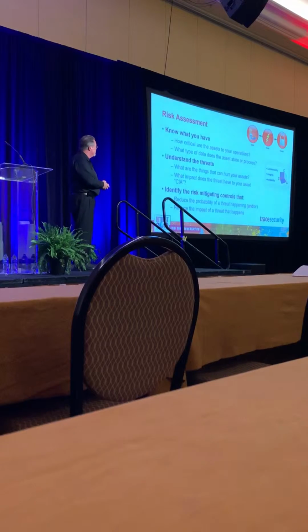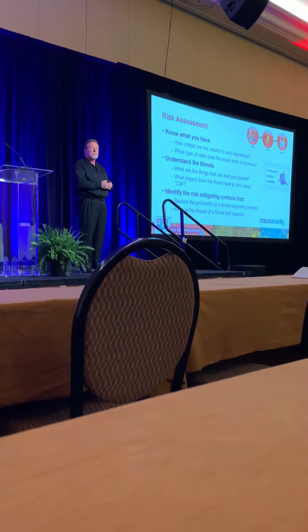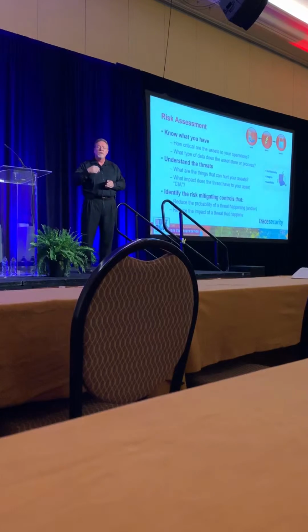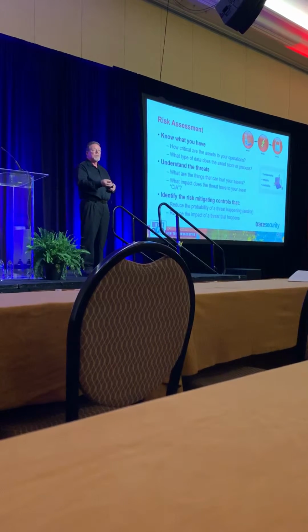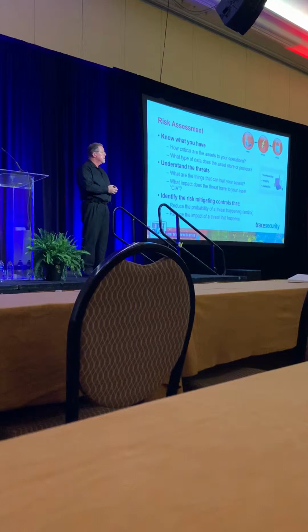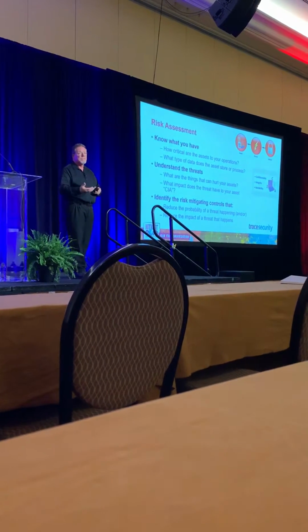So the next step is risk assessment. Now, granted, we could talk about risk assessment methodology all day. We just don't have time to do that, but I want you to understand 3 key points about risk assessment. The first is knowing what you have, and not only what you have, but how critical is it? You know, what is the impact? As John pointed out, the impact might be patient well-being. The impact may be a privacy breach.